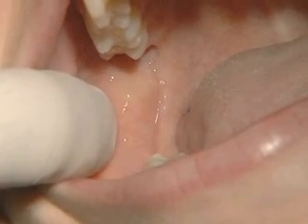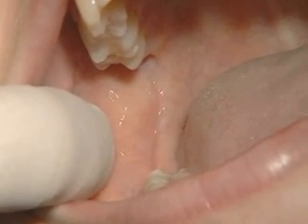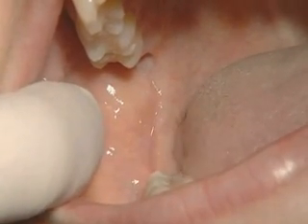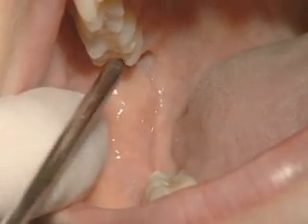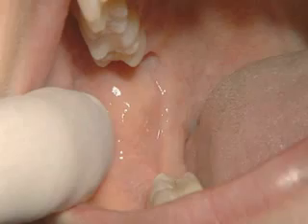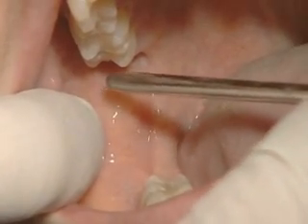It's important to not insert the needle within muscle, so this acts as a lateral guide for the insertion of the needle point. The needle insertion is higher and more lateral for the Gow-Gates block compared to the inferior alveolar nerve block. The height is determined by the maxillary occlusal plane, and very often the needle will lie just below the mesiopalatal cusp of the second molar.